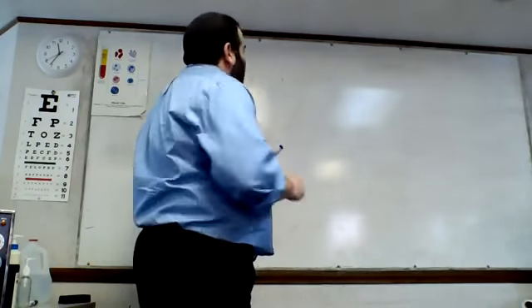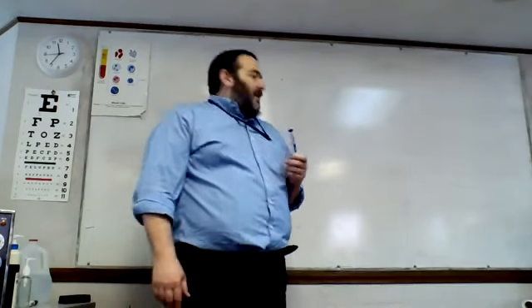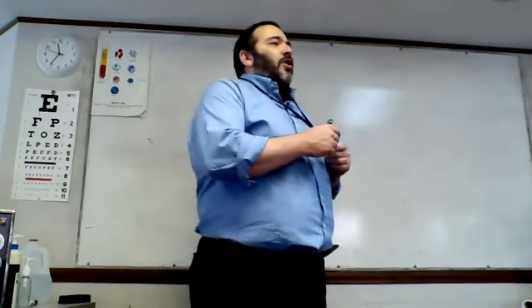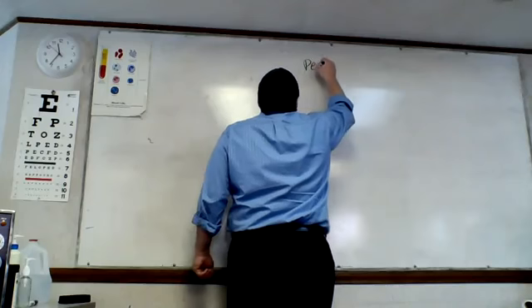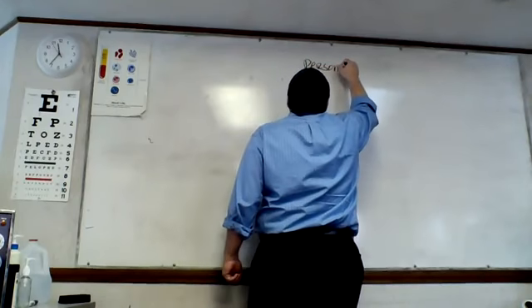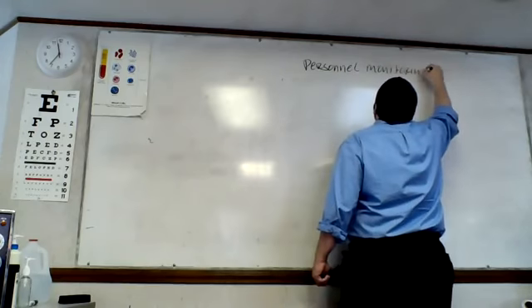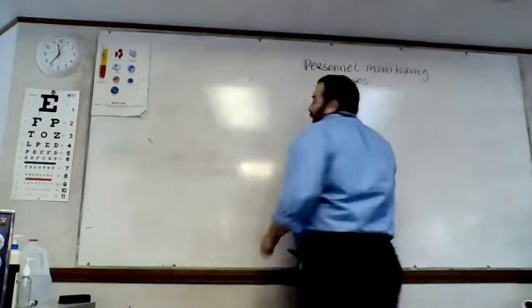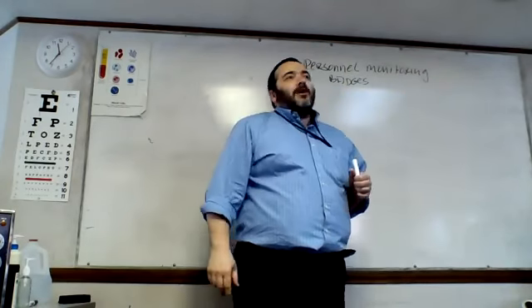So a little more on ethylene oxide. I mentioned to you that there is something that they do called personnel monitoring, right? First things first. Most important for people to wear a personnel monitoring badge.